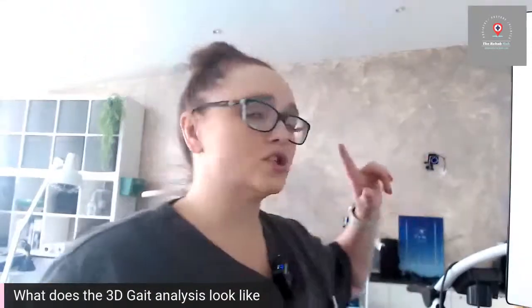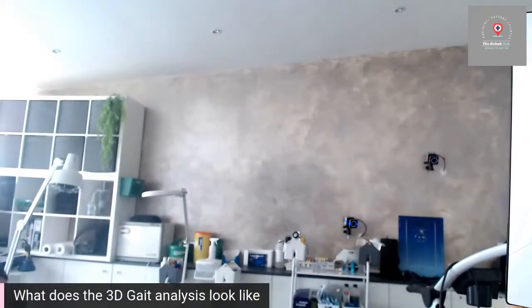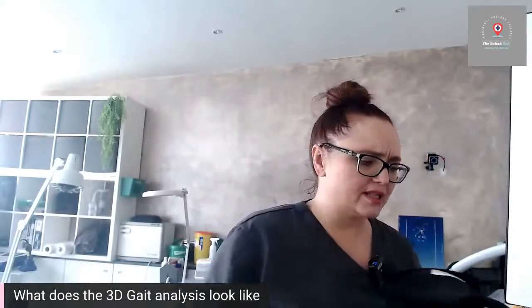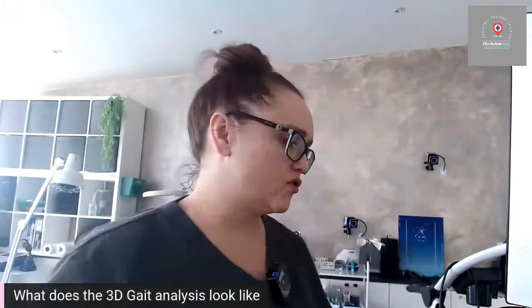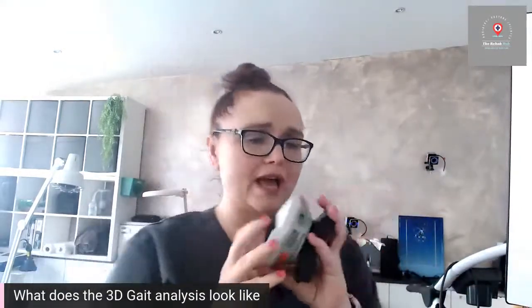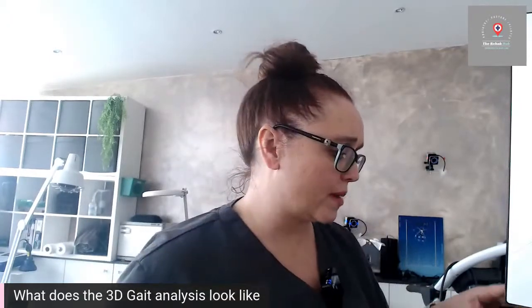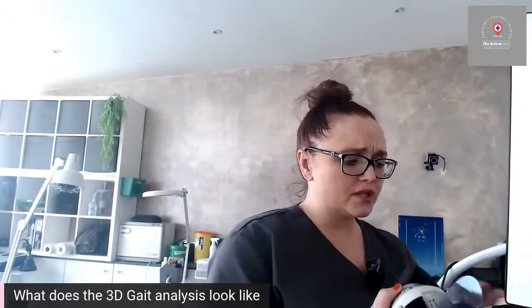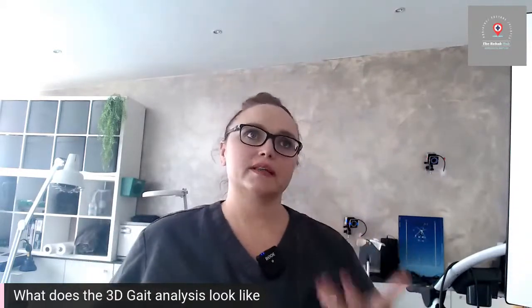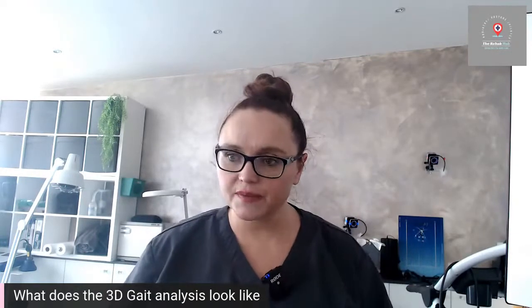When you come in for an analysis with us, we're not just looking at your gait, but we also do a full musculoskeletal assessment. What does that mean? We're looking at your strength. We're doing strength testing, so we'd literally have you resisting against us to actually measure the force that you're able to apply. We would use our goniometers to measure your joint angles to make sure, for example, that you're able to activate the windlass mechanism in your feet.